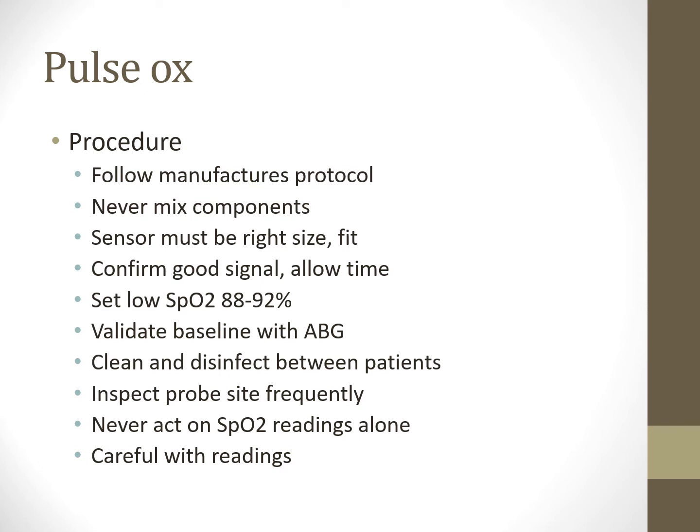You work in pediatrics, you'll see pulse ox signals that look super bad. You go into the room, the kid's jumping around in their little crib, right? So it's something to be aware of. So be careful with the readings. You've got to have a little bit of understanding of, does this fit the rest of their clinical condition?